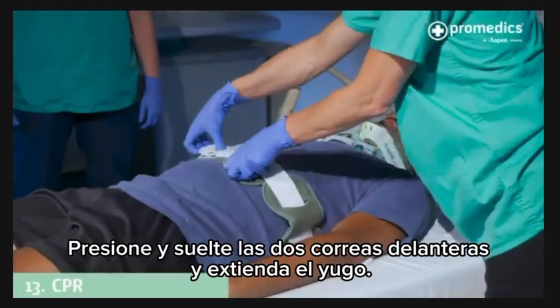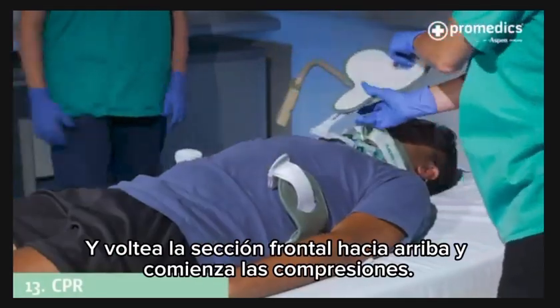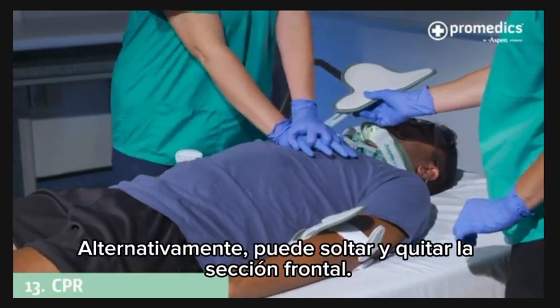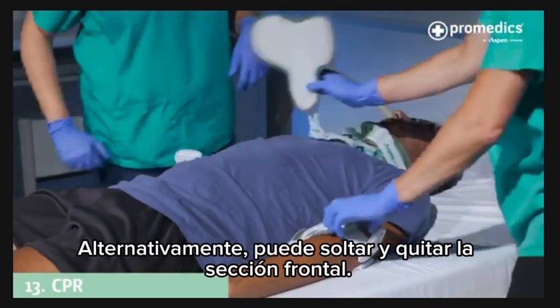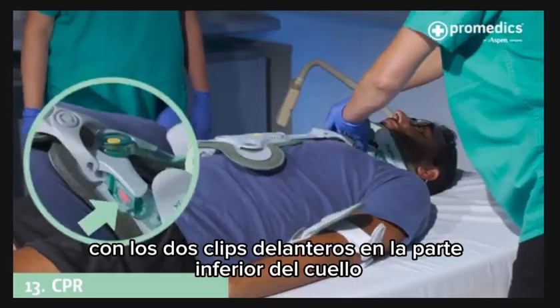Press and unclip the 2 front straps and spread the yoke and flip the front section up and start compressions. Alternatively, you can unclip and remove the front section with the 2 front clips at the bottom of the collar.